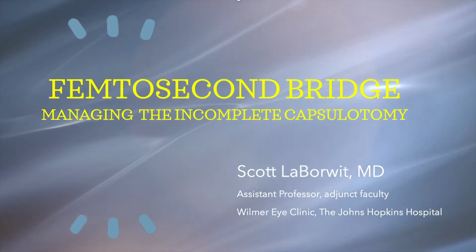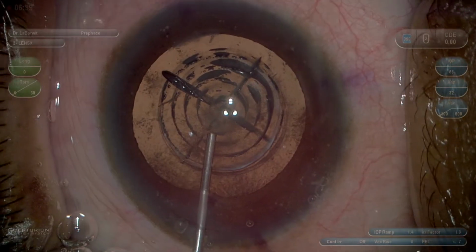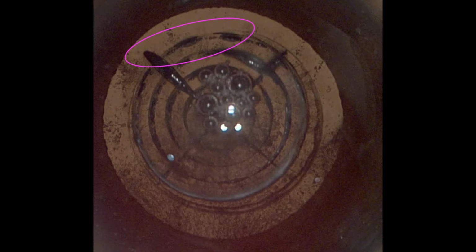This is a video demonstration of an incomplete capsulotomy during femtosecond laser-assisted cataract surgery. I had a gas bubble at the interface I thought would cut the capsule through the bubble. But you can see starting at 12 o'clock, I start to lose the visualization of the complete capsulotomy. It extends about 2 clock hours.